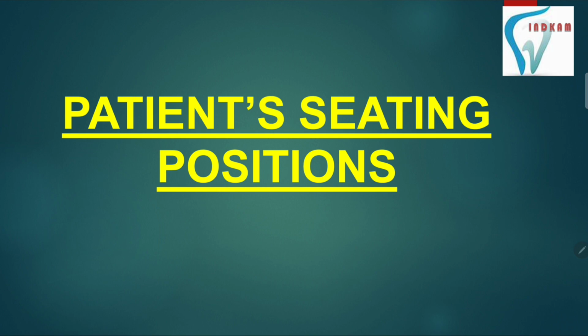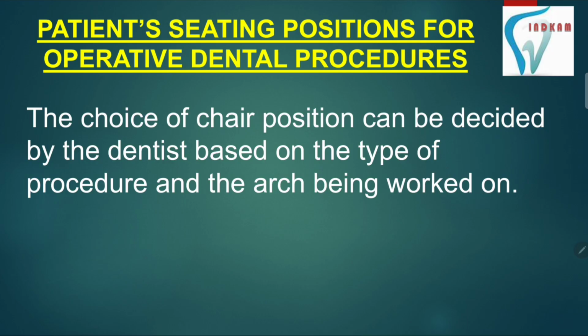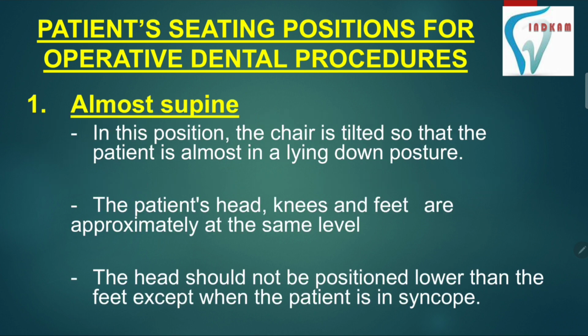Talking about patient's seating positions, the choice of chair position can be decided by the dentist based on the type of procedure and the arch being worked on. For operative dental procedures, the patient may be seated in one of the following positions. The first one is almost supine position.